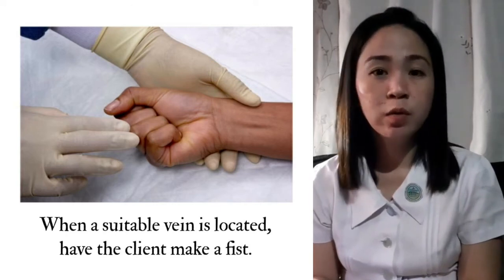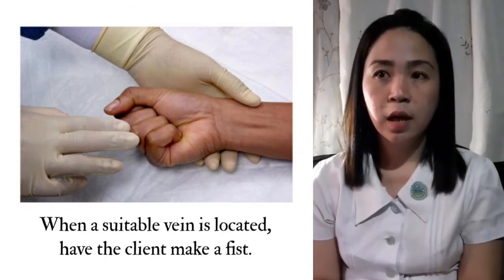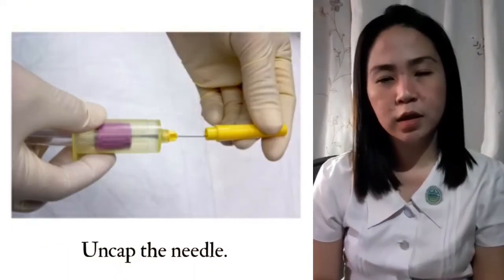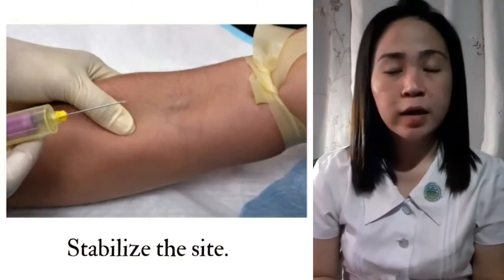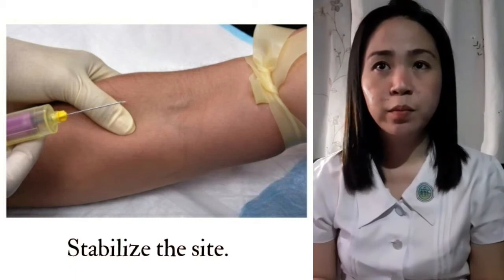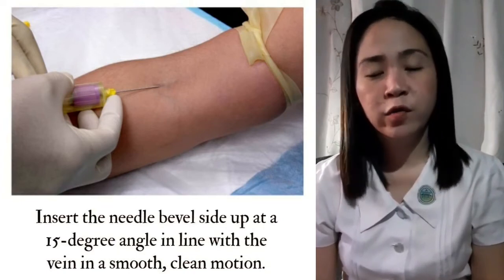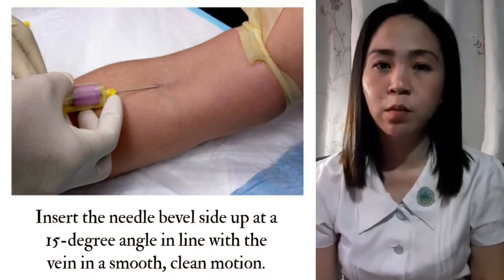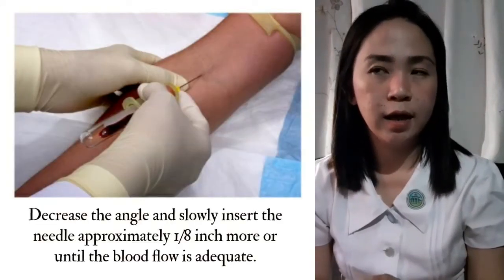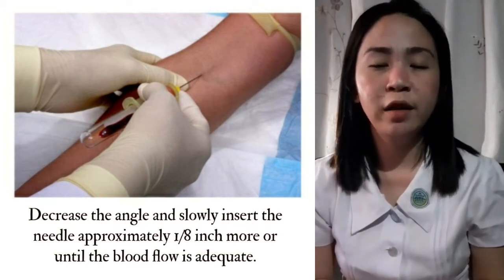When a suitable vein is located, have the client make a fist so the vein becomes more prominent. Then palpate the vein — it should have an elastic sensation without pulsation. Uncap the needle and stabilize the site, making sure the skin is tight before applying the needle, as tighter skin means a less painful puncture. Insert the needle bevel-side up at a 15-degree angle in line with the vein in a smooth, clean motion. When the needle penetrates the vein, a give will be felt. Then decrease the angle and slowly insert the needle approximately one-eighth of an inch more, or until blood flow is adequate.